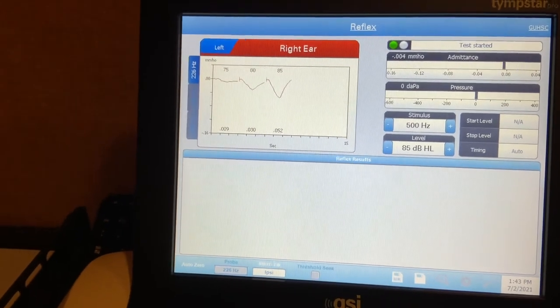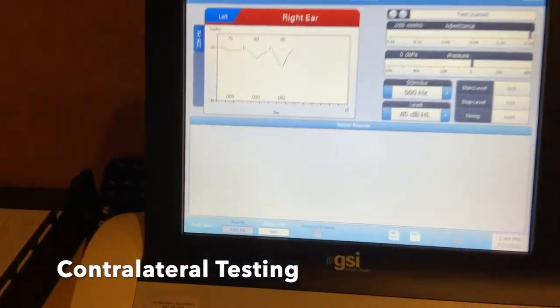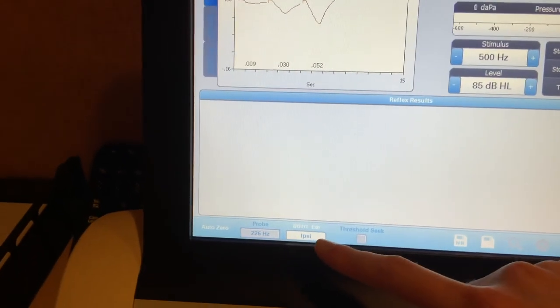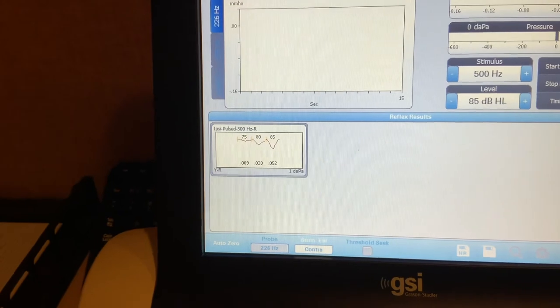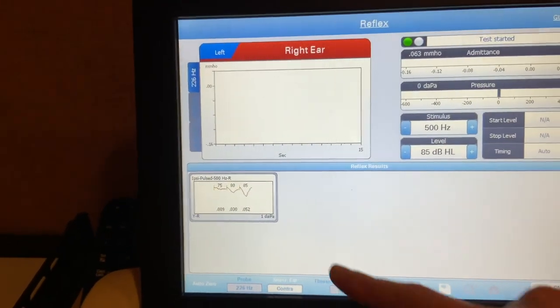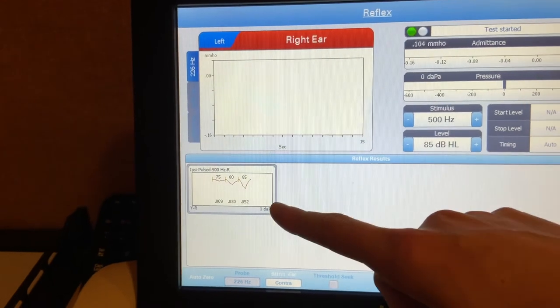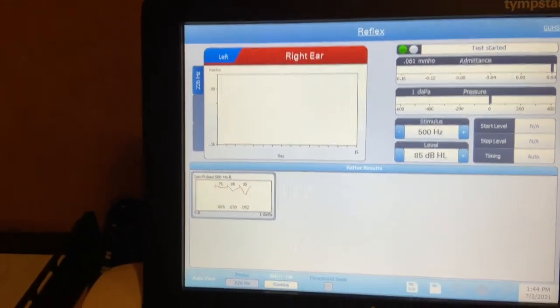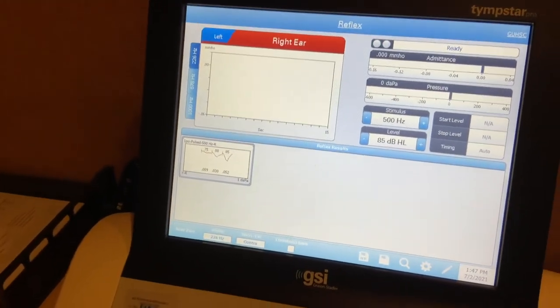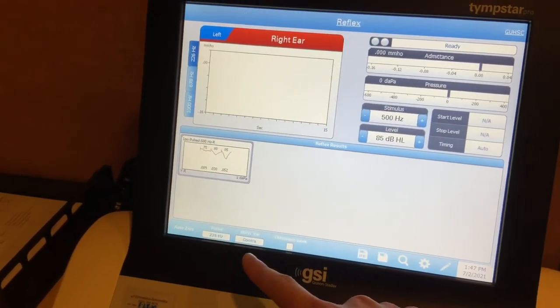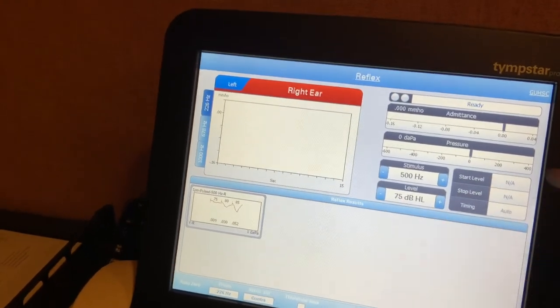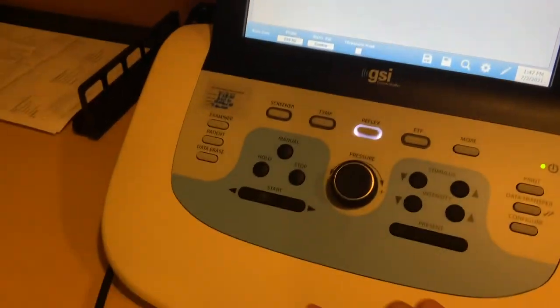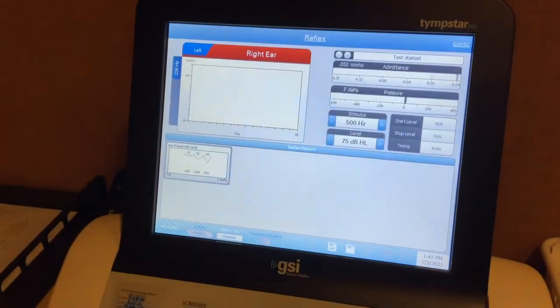To do contralateral testing, you're going to come down here to the stimulation ear and you're going to just hit it. And it'll switch over to contralateral. As you can see, it also saved the responses from your other test. So now that we have switched it over to the contralateral ear side, we are going to make sure that we're starting at an appropriate level that we want. And we're going to hit start again to get the pressure going and then present.